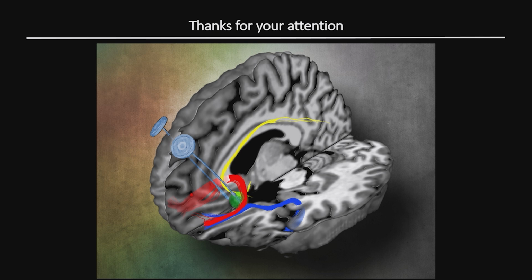So far, we don't see clear side effects in these patients unless we really give them a high amplitude. We started with around 4.5 milliamps at this point. However, sometimes we go up to around 6. We do a bunch of other experiments here, like LFP and behavioral tasks, so sometimes we gave really high amplitude. In that case, we see something like the mania you mentioned. However, with our typical standard amplitude, we don't see many adverse effects.